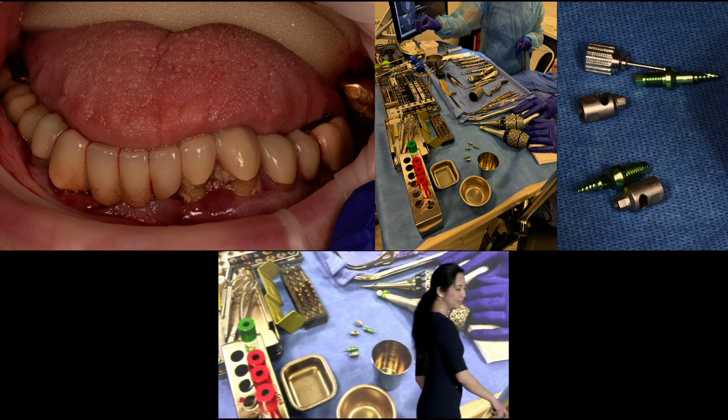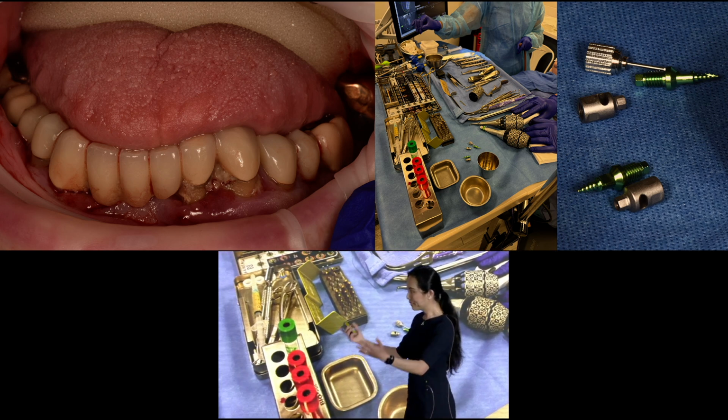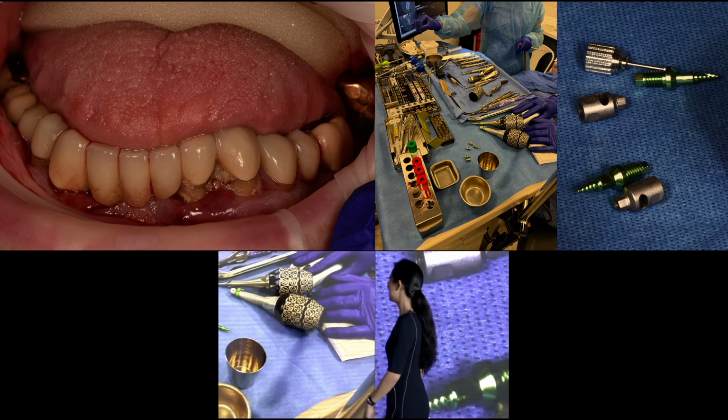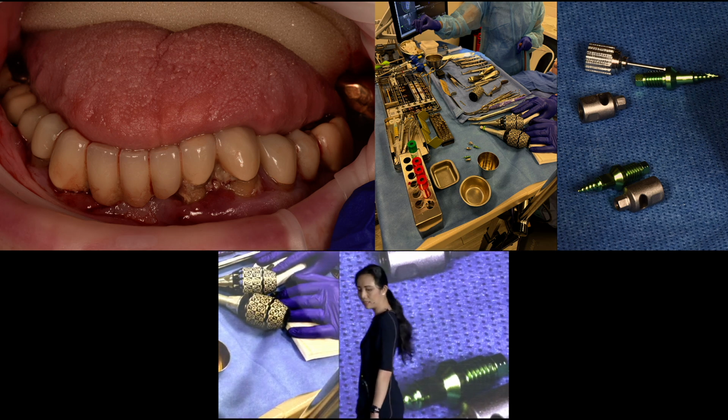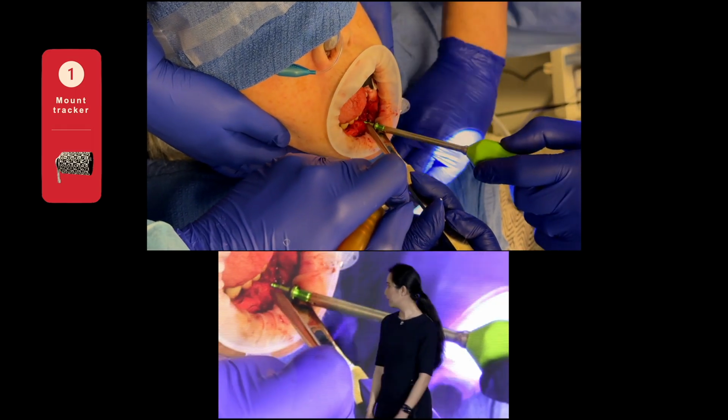So this is the patient sedated. Here's the pre-op. So you can see the FPD was actually as distorted as it was reflected in the digital design. Here's the entire setup where we're ready to attach everything. Step one is to mount the tracker.